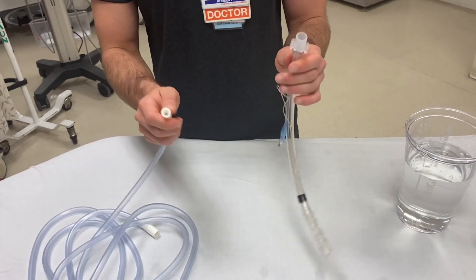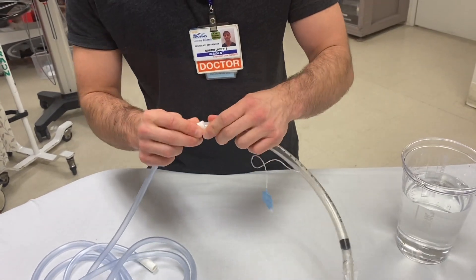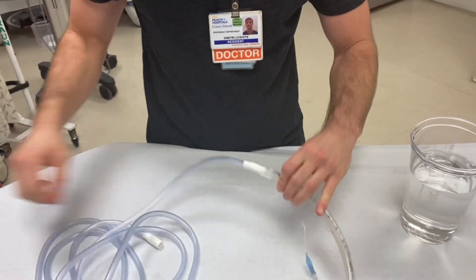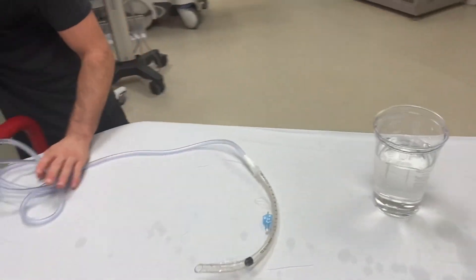Okay, so you're going to connect the suction tubing to the ET tube adapter — just like that, so it's nice and snug. Then you hook this up to suction.